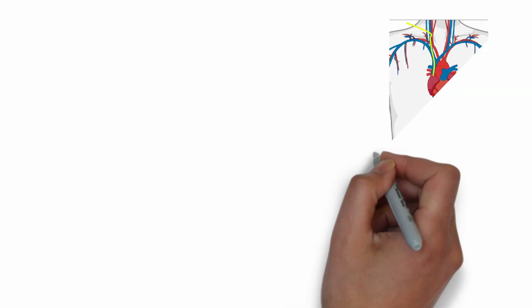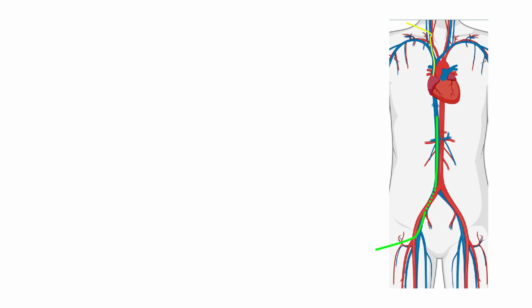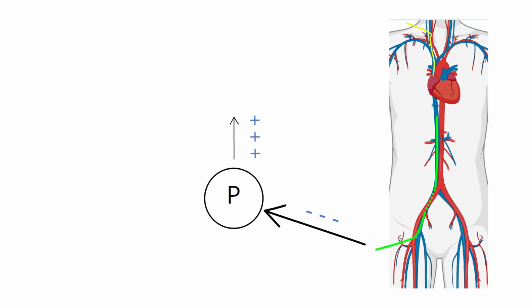positioned correctly. The venous drainage cannula is connected to a centrifugal continuous flow pump which creates negative pressure or suction on the venous cannula to pull the blood out of the body. The pump then pushes blood out from its outlet with a high positive pressure and through the oxygenator. As the deoxygenated or blue blood passes through the membrane oxygenator, it gets oxygenated and carbon dioxide is removed.